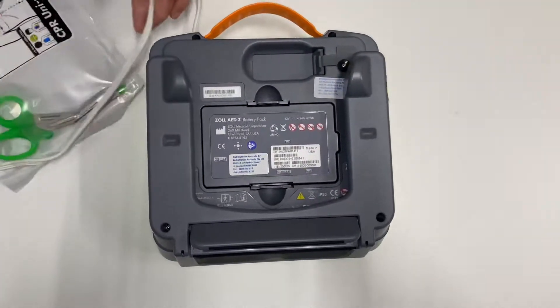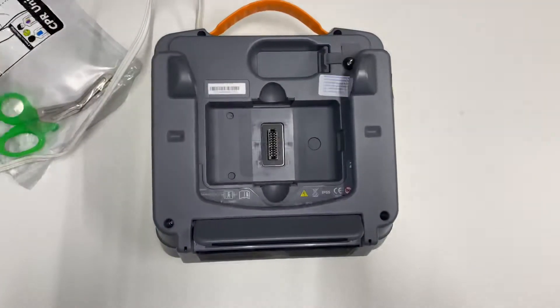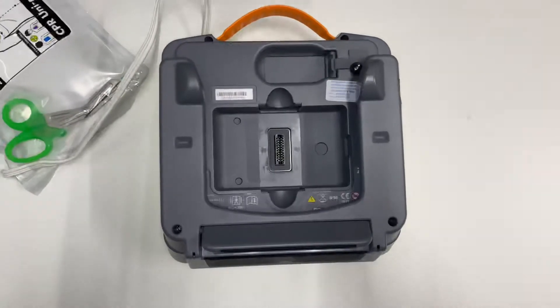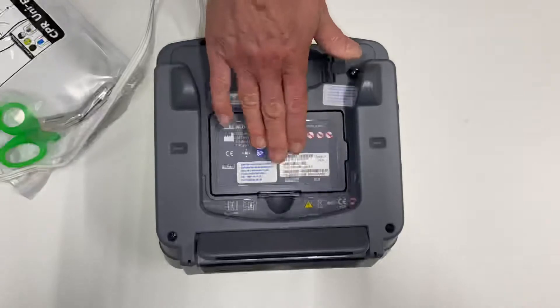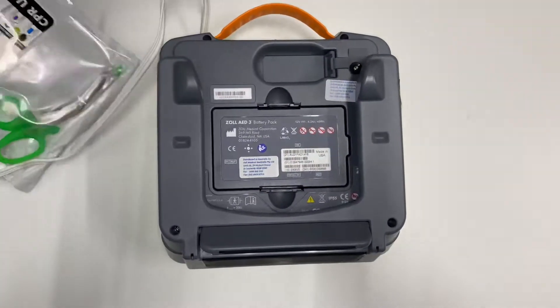You'll see the old AED3 battery. Unclick it and pull the battery out. Then take your new defibrillator battery, insert it, and push down until you hear a click. Now you can put the pad packet back in.